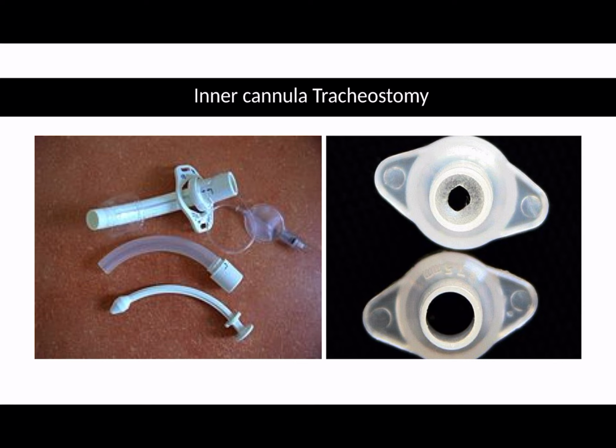It is not uncommon for people to think that there's an inner cannula, try yanking on the end of it and accidentally extubate the patient, because actually that type of tracheostomy did not have an inner cannula at all. So, key point, not all tracheostomies have inner cannulas. If it does have an inner cannula, it'll be obvious. It usually says on the collar of the tracheostomy, but also if you have a look at the pack for the like-for-like tracheostomy next to the patient's bed, you can have a little play and see if they do have this little plastic insert in there.